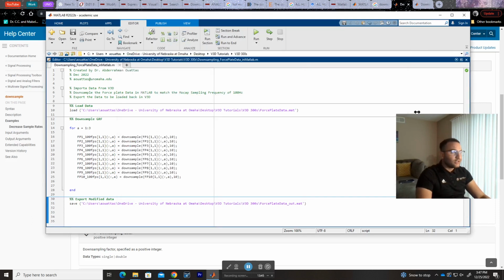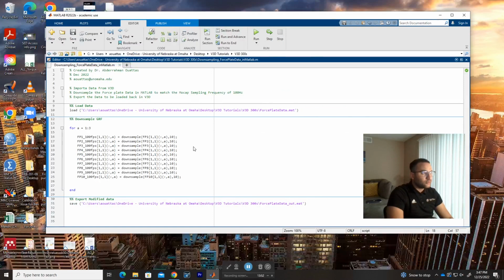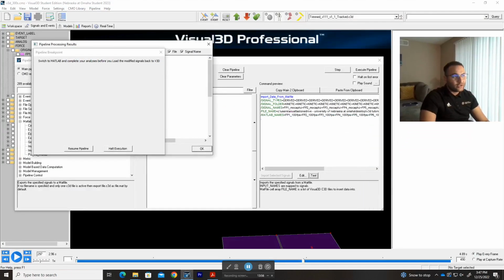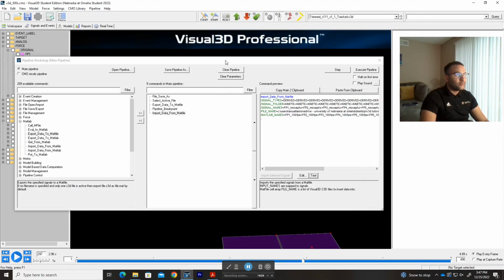Alright, so now what we need to do is go back to Visual 3D, and we can resume the pipeline. Just make sure you have the name and everything correctly. So let's resume the pipeline, and then it will give us 0 errors, so everything has been exported and imported fine.